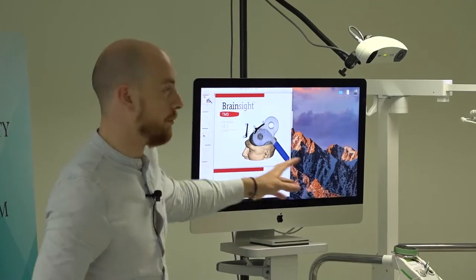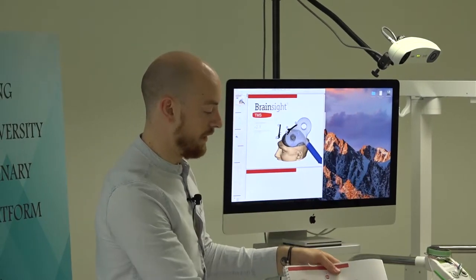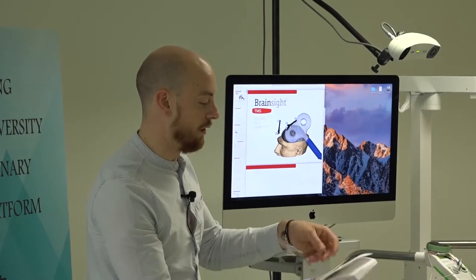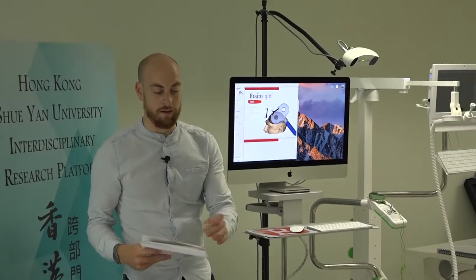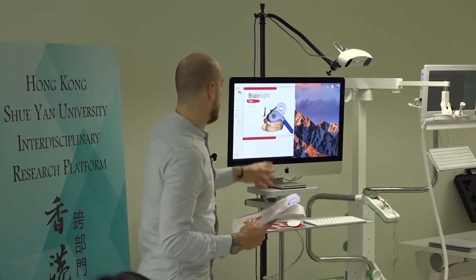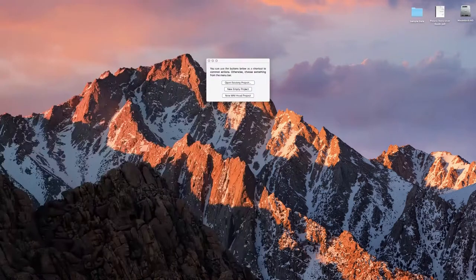Should you upload BrainSight onto another computer there, that's your unique serial number if it's going anywhere else. And as well, there's sample data on there. That's a USB there with some nice sample data on it, which has got the head project on it. So there's two ways.